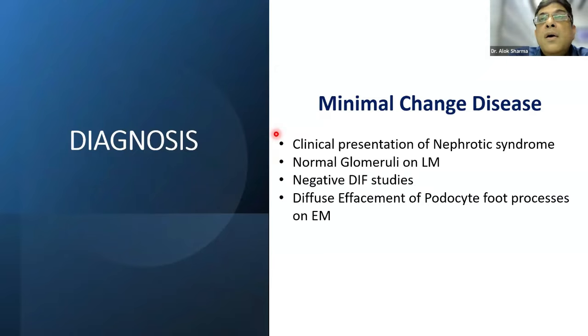The reason being, if you have a biopsy, which we saw in this case, right? 8-year-old child. Suppose we take it the other way around. If you have a biopsy of an 8-year-old child in which the glomeruli are absolutely normal, but I'm finding some areas of tubular atrophy, interstitial fibrosis, although they may be very small, but they are there. I do not expect this in an 8-year-old child, right? So there I would say, yes, although I'm not seeing an FSGS lesion upfront in my biopsy, it could be a sampling error, and there is a possibility that an FSGS has not been sampled in this biopsy core.